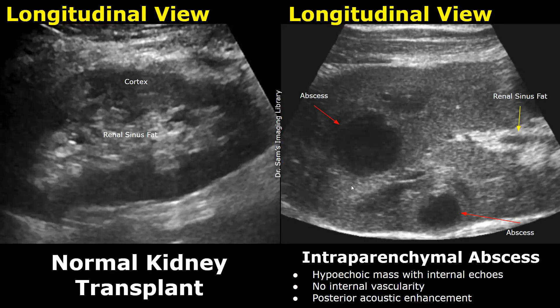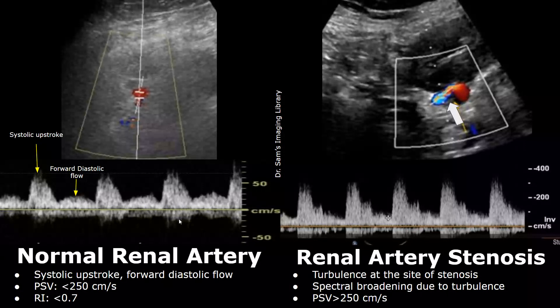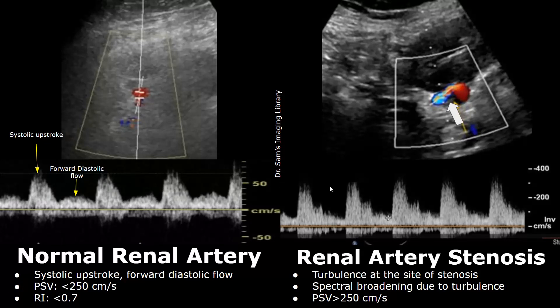Here is a normal renal artery and its spectral Doppler in a renal transplant. The waveform has a systolic upstroke and forward diastolic flow. The peak systolic velocity should be less than 250 centimeters per second in normal cases, and the resistive index should be less than 0.7.